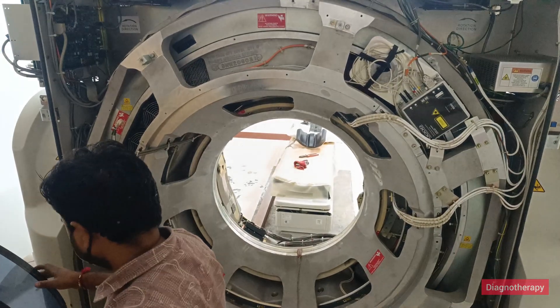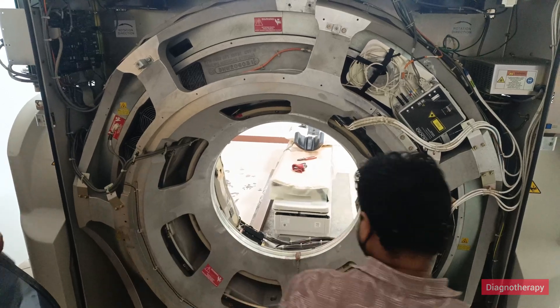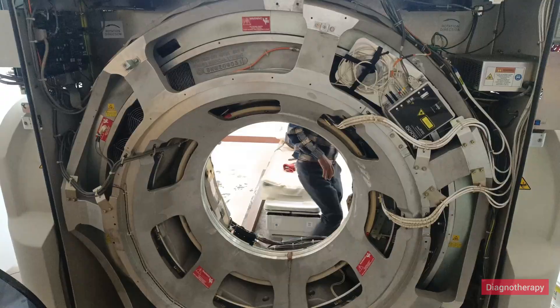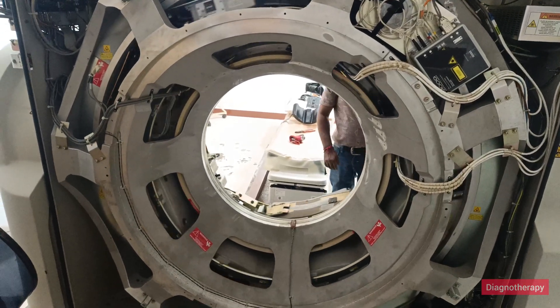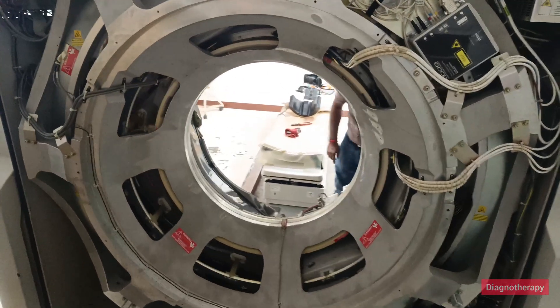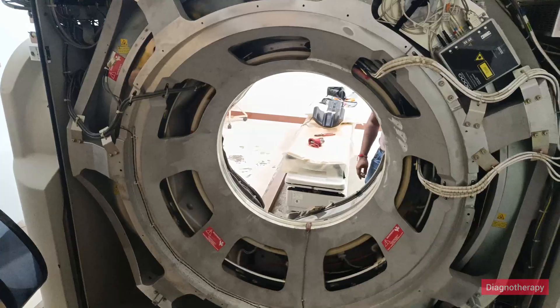Now we will move the CT scan manually from the front side — the x-ray tube and detector — and observe the slip ring from the back. The detector, x-ray tube, and tank are moving. The main communication happens through a technology called slip ring, which helps in communication of information and power.